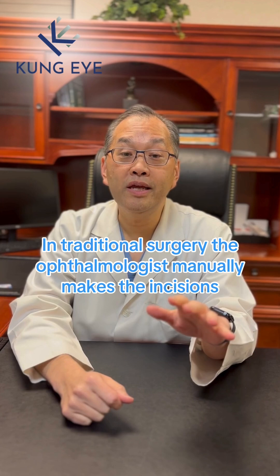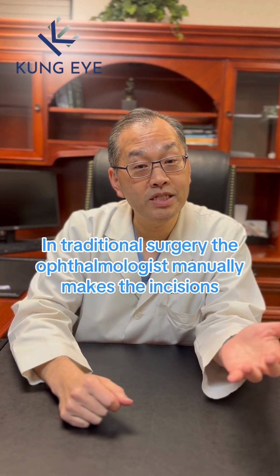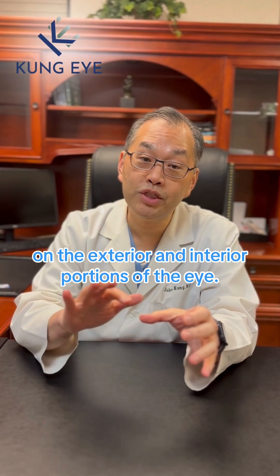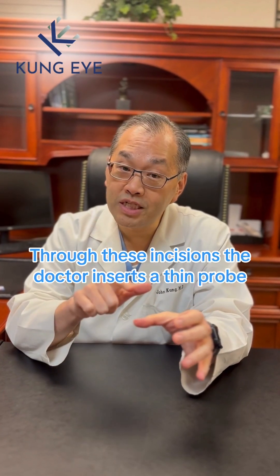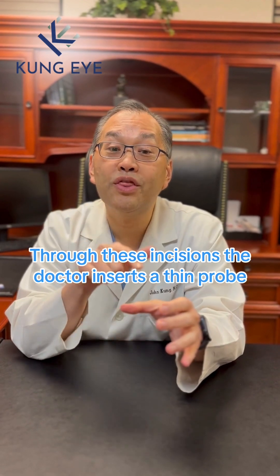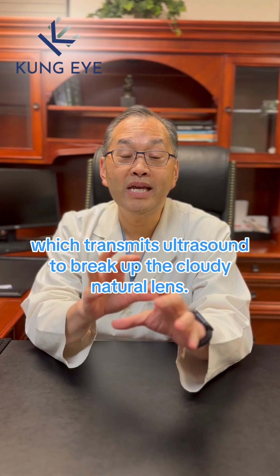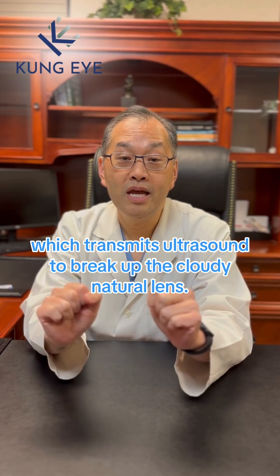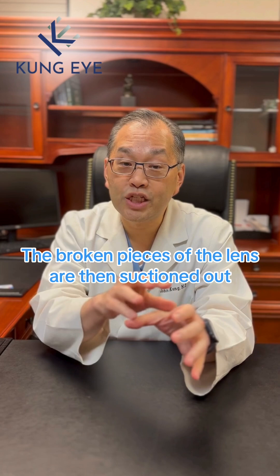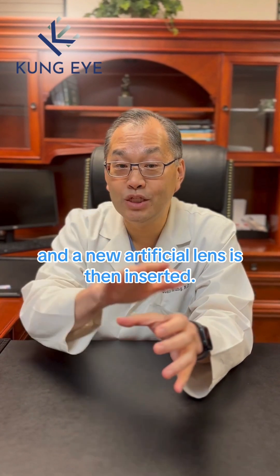In traditional surgery, the ophthalmologist manually makes the incisions on the exterior and interior portions of the eye. Through these incisions, the doctor inserts a thin probe, which transmits ultrasound to break up the cloudy natural lens. The broken pieces of the lens are then suctioned out and a new artificial lens is then inserted.